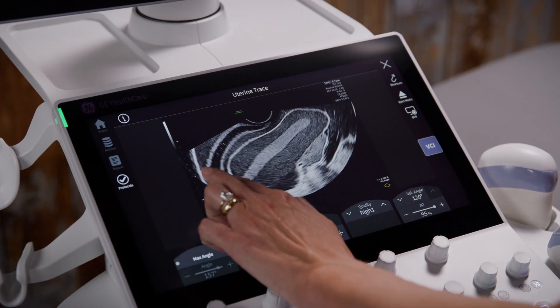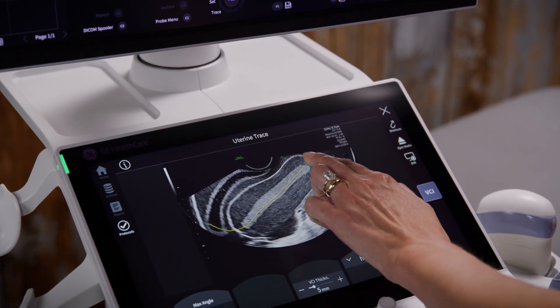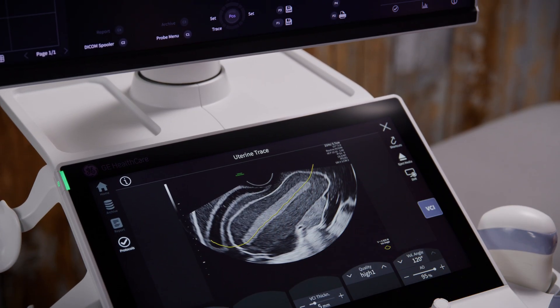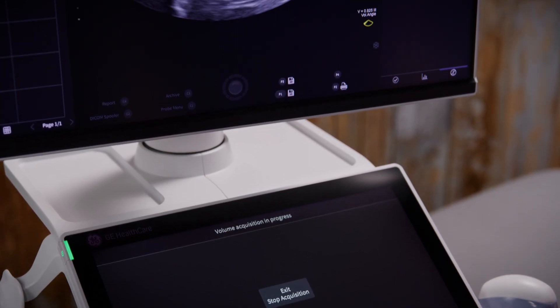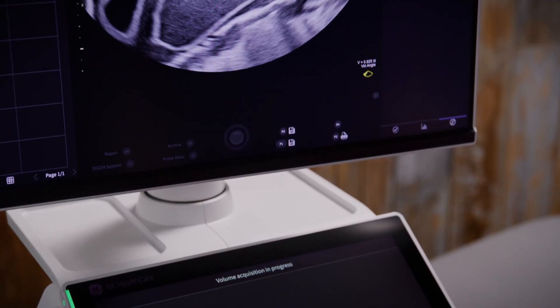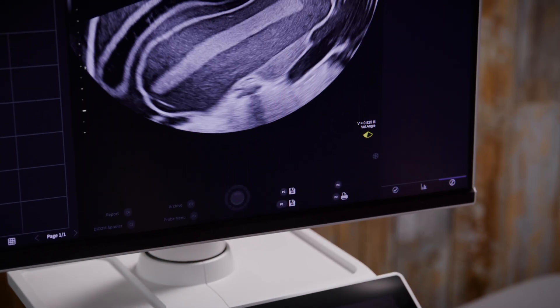Using your finger, trace a line through the endometrial cavity from the uterine fundus to the cervix. As soon as you release your finger from the touch screen, the 3D acquisition will immediately begin.